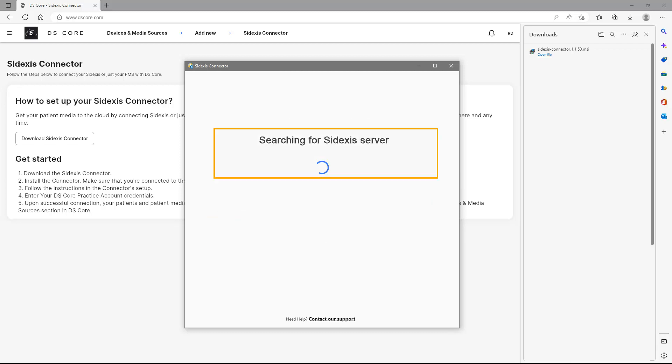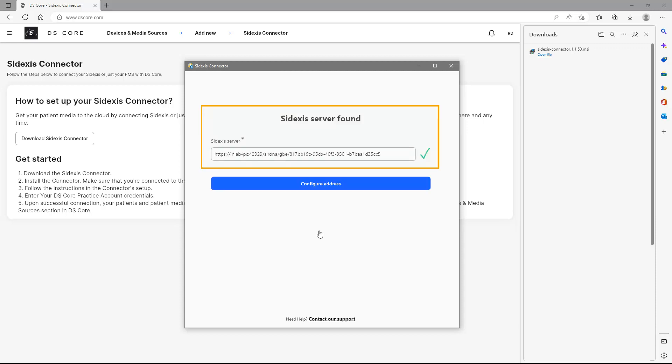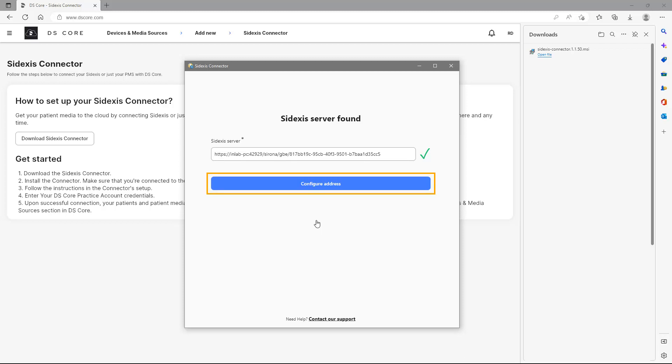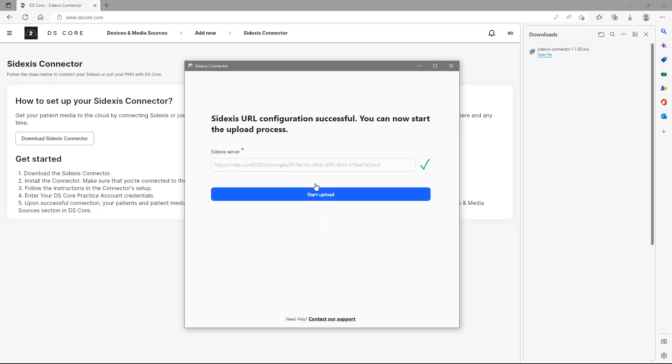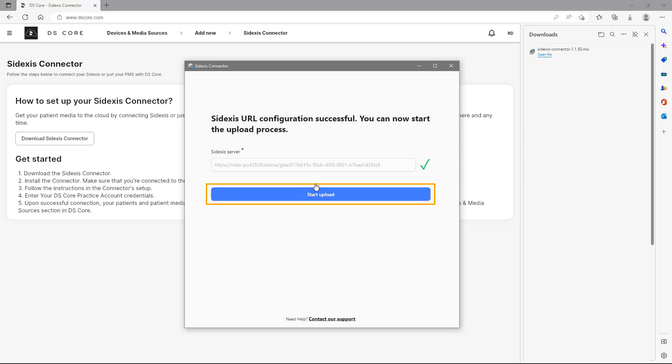As soon as the Sidexis server is found within the practice's network, we receive a confirmation. Next, we tap on Configure Address. After the Sidexis URL configuration was successful, we activate the automated upload of files from Sidexis into DS Core.